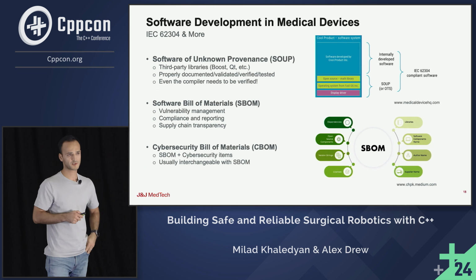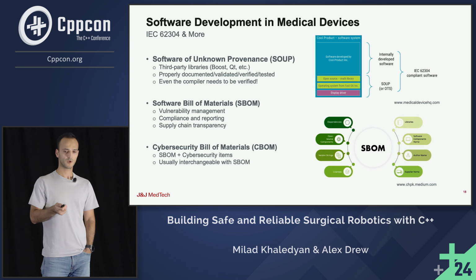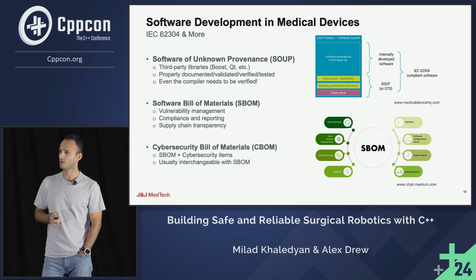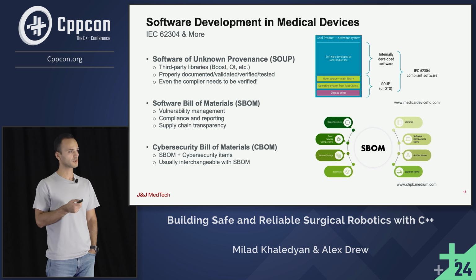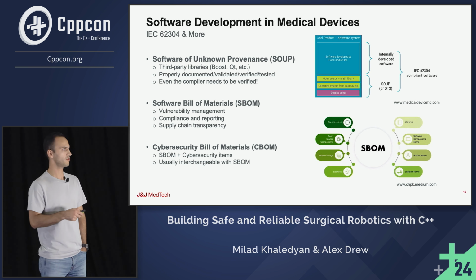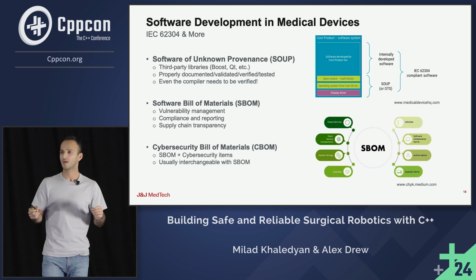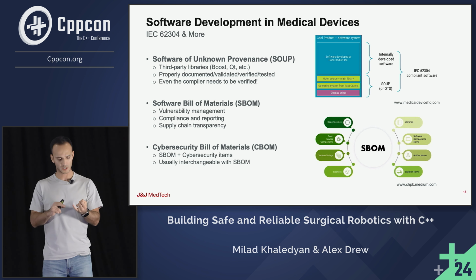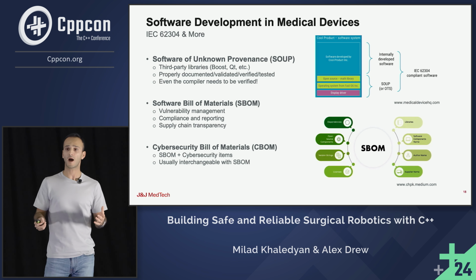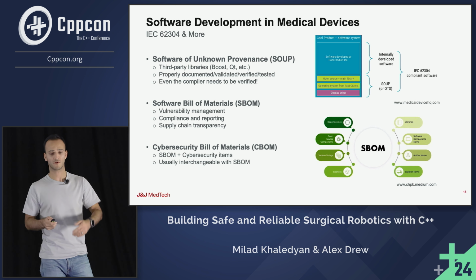The last piece about 62304 is the concept of SOUP, SBOM, and CBOM. SOUP, as you may know, is software of unknown provenance. Anything you do not develop in-house is considered SOUP. Your third-party libraries, your operating system, even your compiler, that's part of your SOUP. SOUP has to be absolutely tested, verified, documented, and validated. Even the output of your compiler has to be validated and submitted as a document to the FDA.